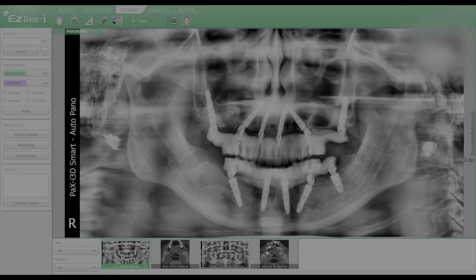But we were able to get nice, steady, strong support for her teeth so that we could avoid cantilevers, right? So even though she has large sinuses, we were able to engage different types of techniques without doing a sinus lift, just because we've done so many of these. This allowed this patient to avoid having it look like she was missing some teeth when she smiled, or that she wouldn't be able to chew properly.